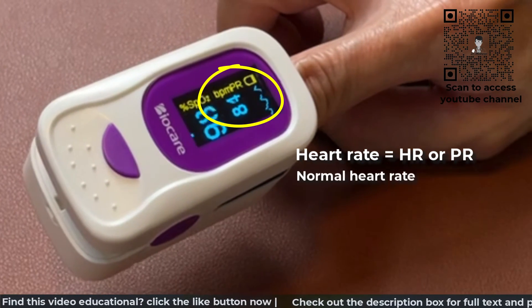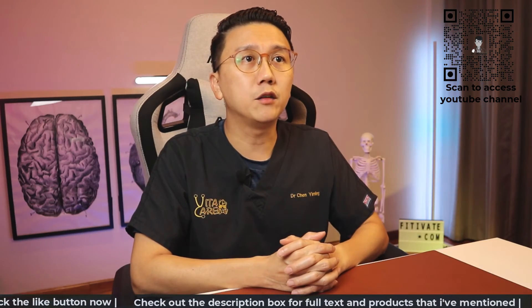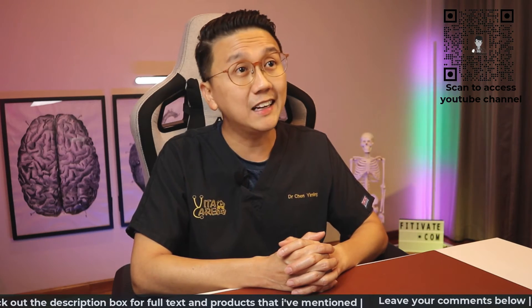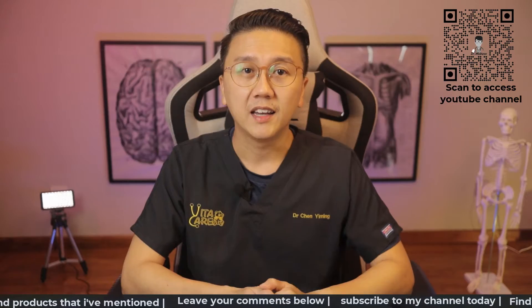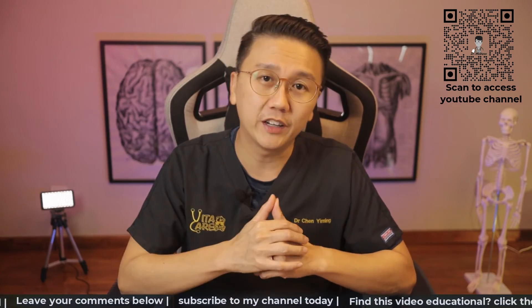Generally, we accept normal heart rate in adults as between 60 to 100. As I've discussed in my other video on healthy heart rate, some very fit adults may have heart rates slightly lower than 60 — feel free to access that video by clicking on the top right of your screen. In cases of COVID-19 infection, the heart rate tends to be higher, usually more than 100.